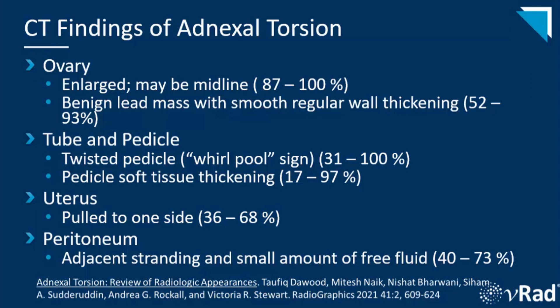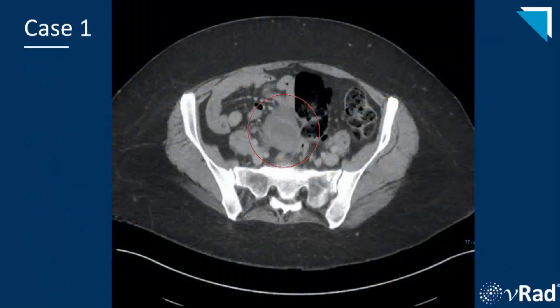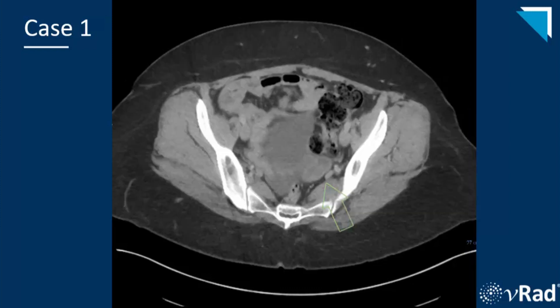In our first case, this axial non-contrast CT for flank pain shows an enlarged right ovary, surrounded by the red circle, abnormally positioned in the midline of the pelvis. The green arrow demonstrates the normal size and location of the left ovary, as well as free fluid. We want you to get used to finding each ovary on CT to get an idea of its typical location and appearance, so as we go over these cases, keep an eye out for the normal ovary as an internal control.